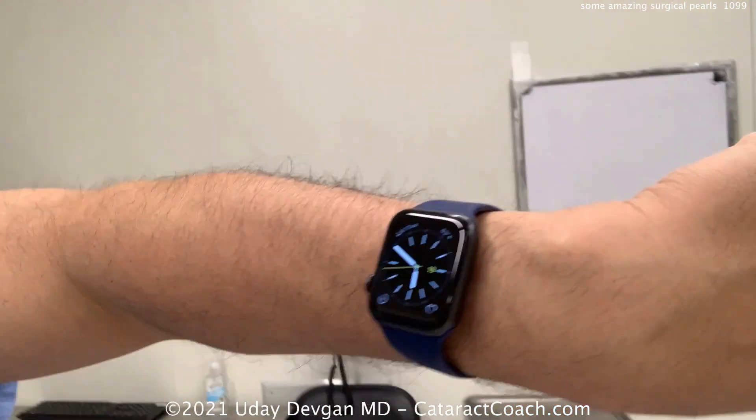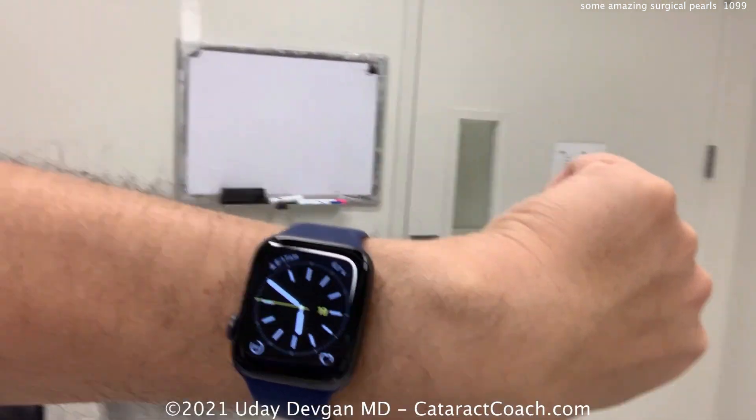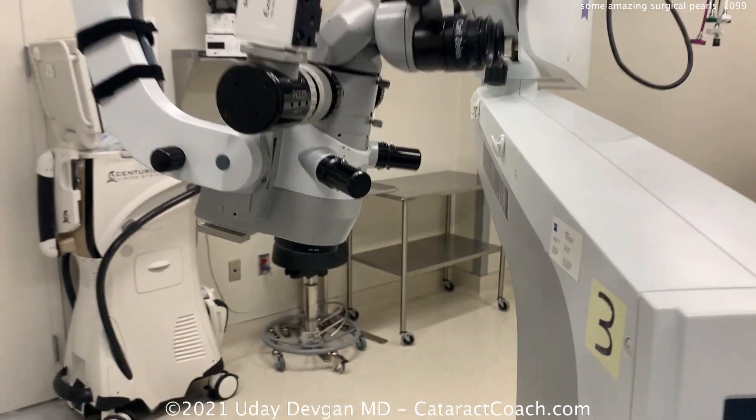First thing: when do you get here? It's about 10 minutes before six, and I've already been here about 20 minutes. I get here at least 45 minutes — or even an hour — before the scheduled start time. Why? To prepare everything, set up our machines, and check the microscope.